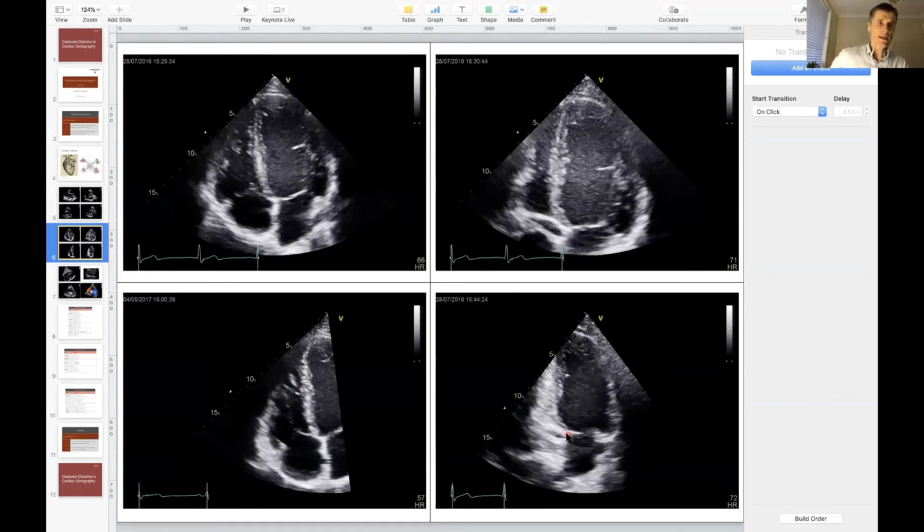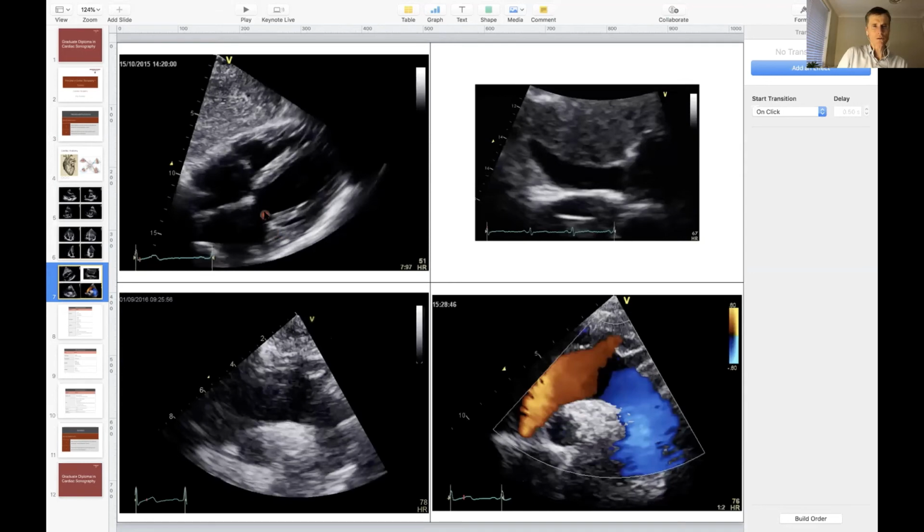One of the important components of the mitral valve, as you'll remember from the lecture, is the annulus. It's an important component of all the valves, but what I want to reinforce to you is the importance of the mitral valve annulus. And you can probably appreciate that there's an area of brightness just across here, and that does correspond to the mitral annulus. In fact, in certain diseases that annulus can become very calcified and become particularly clear, and mitral annular calcification is an important thing to identify. We can see the mitral valve from subcostal views too.